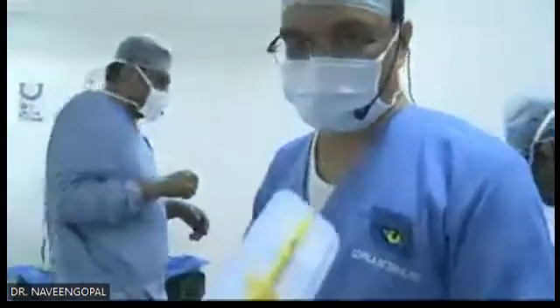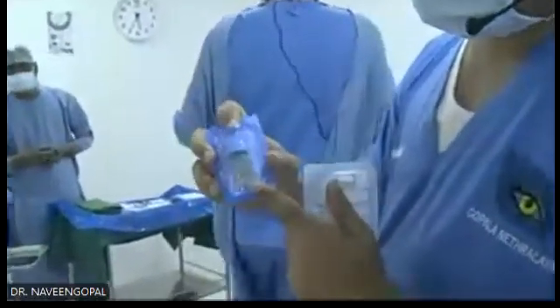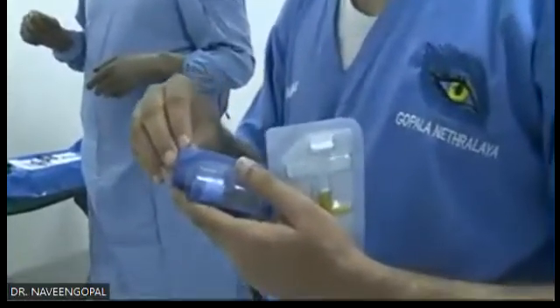This is the injector, and this is the lens, which is in a solution filled in a glass bottle. So we are going to show the process of loading the lens.